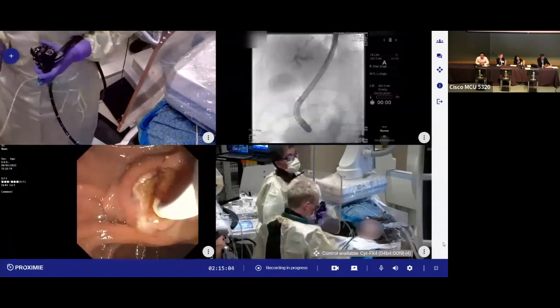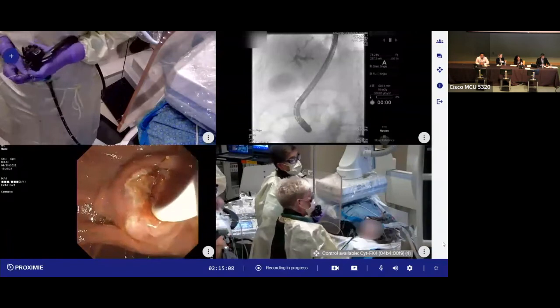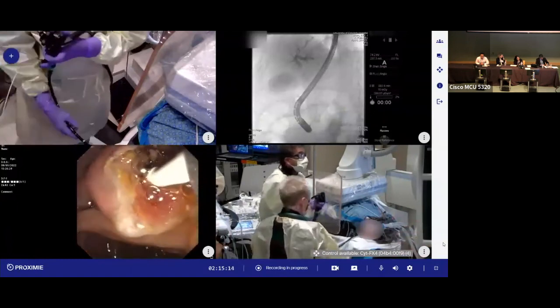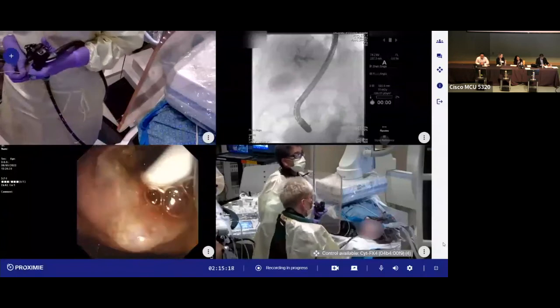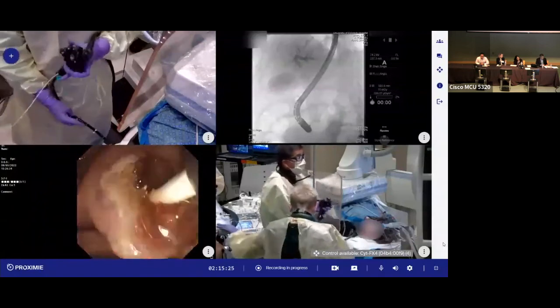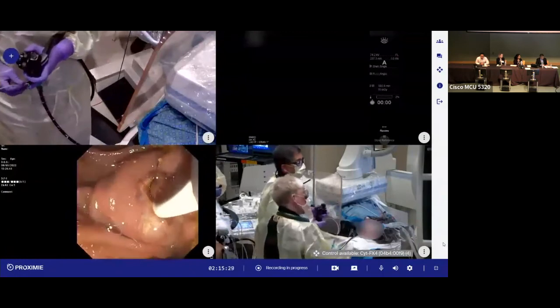And then mechanical lithotripsy would be another option. SPY takes a little bit more time, and there are other costs associated with it. It's a disposable scope. You get the EHL out, the laser out, and several $1,000s later, you're doing that case. It's not like those CRE balloons are cheap either, but I just think they're more expeditious and faster.